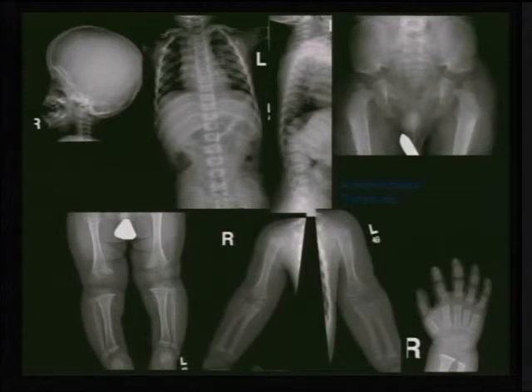Achondroplasia also has a very specific picture. Short base of the skull. If you look to the spine, in the normal vertebrae, you have the interpedicular distance getting wider between L1 to L5. Here it is the reverse. L1 is wider than L5. So this is specific. If we look to the lateral of the spine, we see narrowing of the spinal canal, and there is curvature, scalloping of the posterior aspect of the vertebrae.